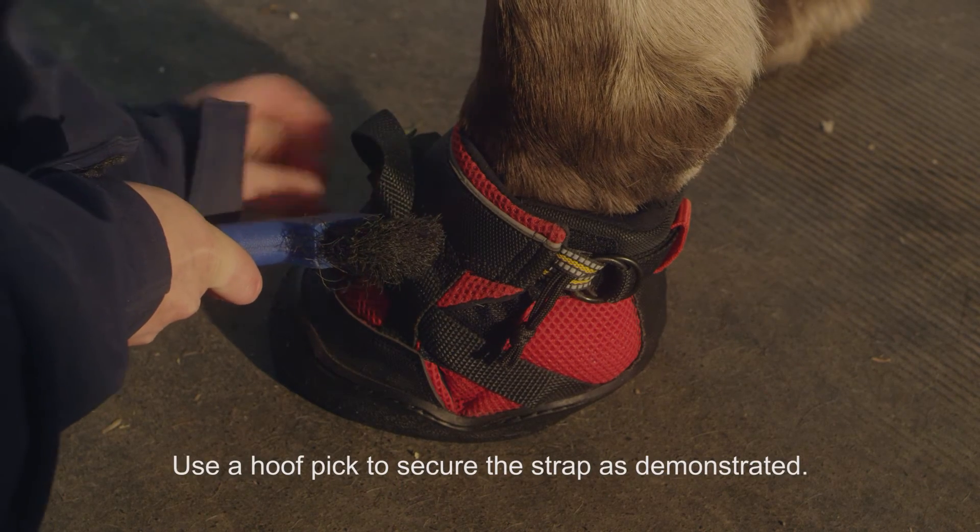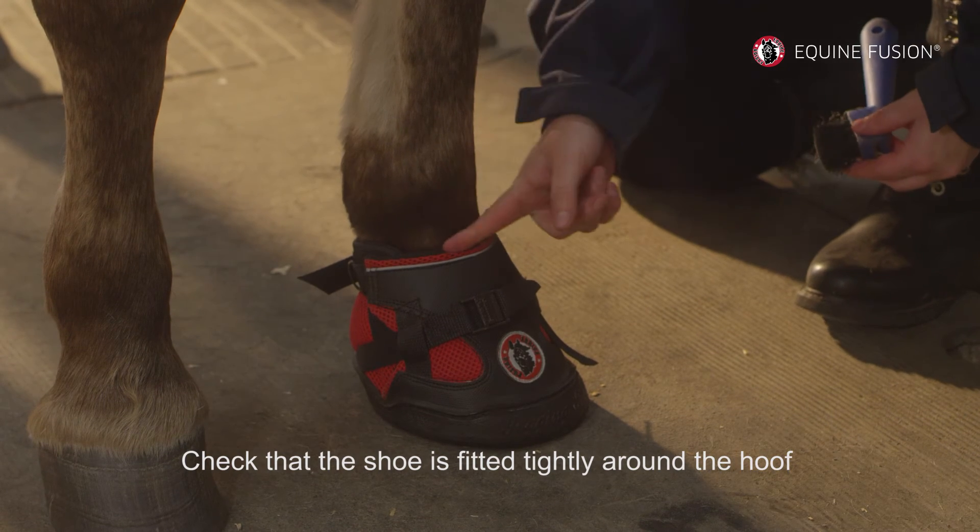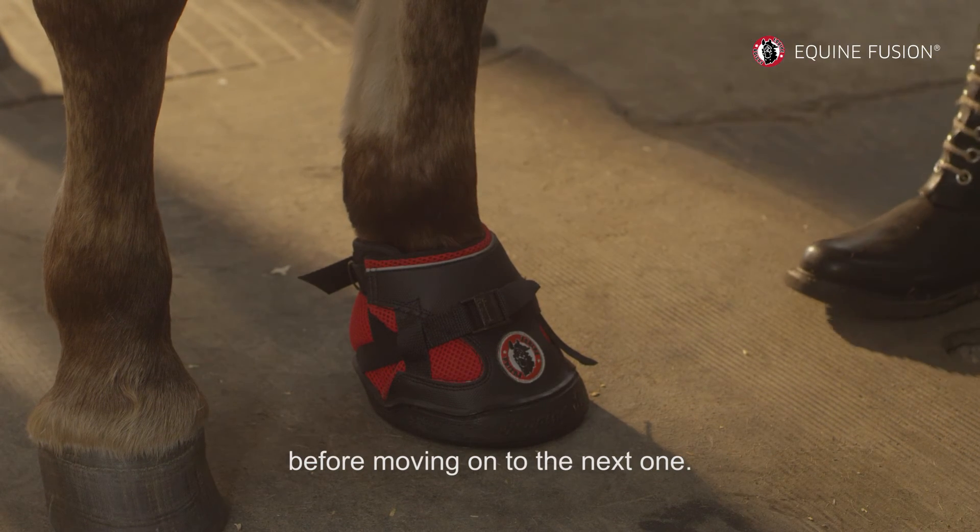Use a hoof pick to secure the strap as demonstrated. Check that the shoe is fitted tightly around the hoof before moving onto the next one.